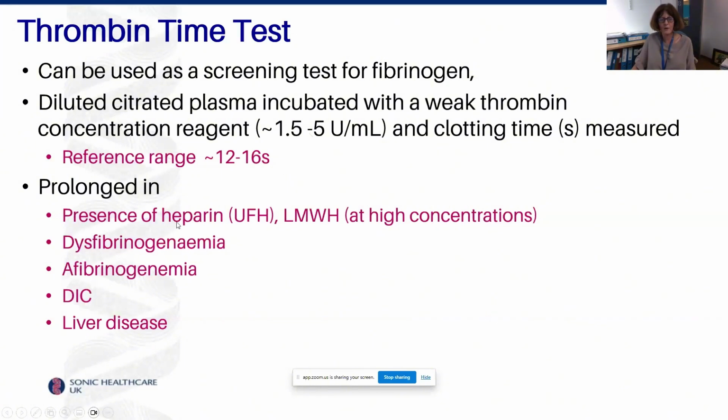As I said, it's always prolonged when unfractionated heparin is present, and with high concentrations of low molecular weight heparin. It's prolonged in dysfibrinogenemia and low fibrinogen, DIC, and liver disease.